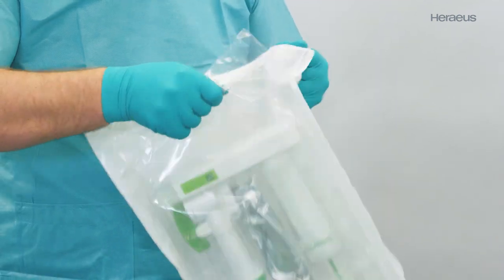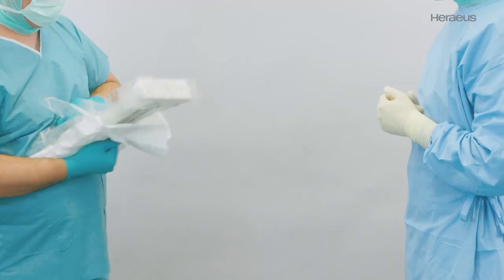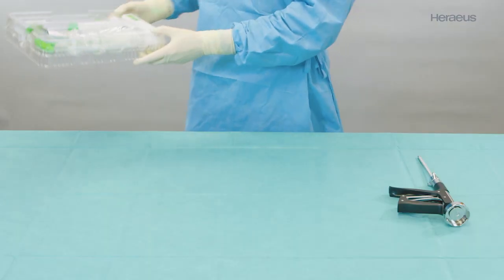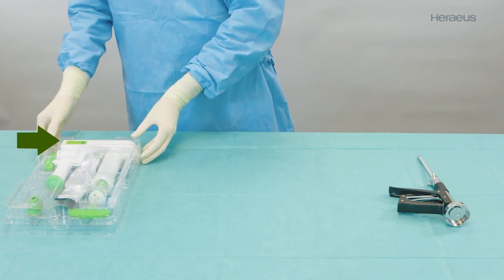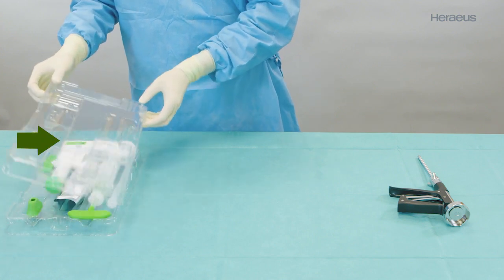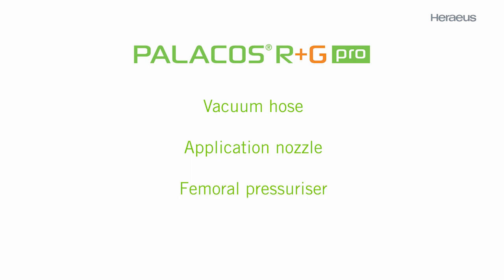Open the inner bag to remove the sterile blister and place the product on a sterile table with the green label facing up. The blister of the Palicos Pro all-in-one fixation system contains a vacuum hose, an application nozzle, and a femoral pressurizer.